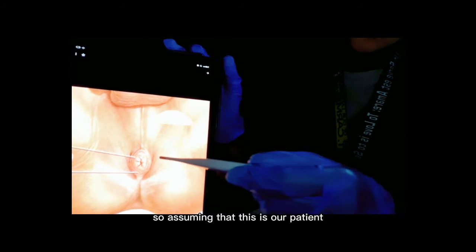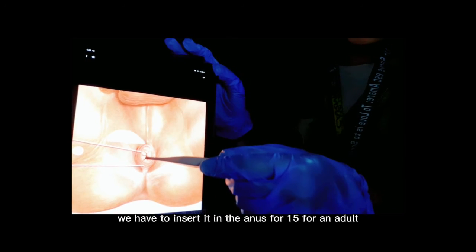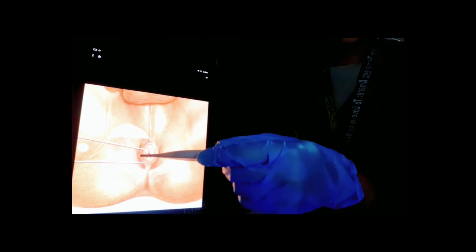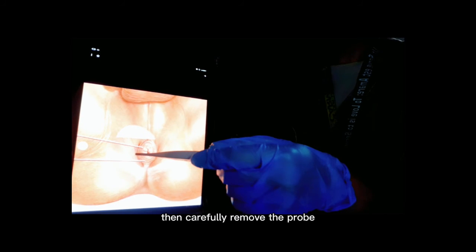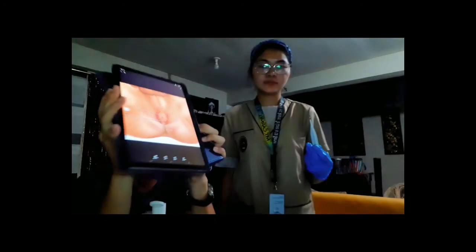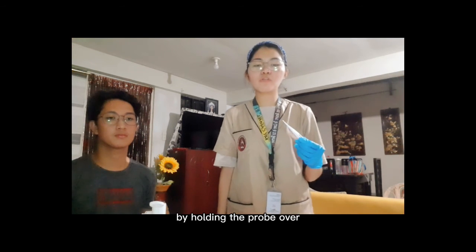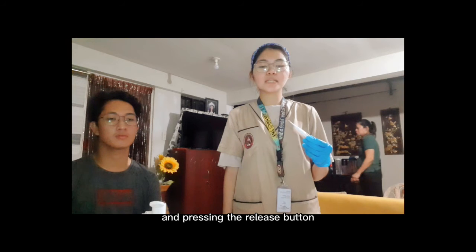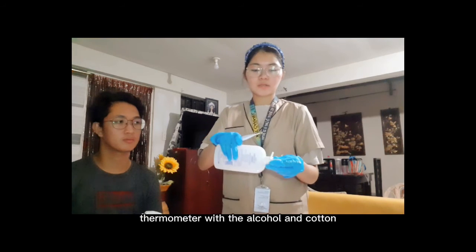So, assuming that this is our patient, we have to insert it in the anus for 1.5 inches for an adult and 1 inch for a child. Then hold the probe in place until we hear a beep. Then carefully remove the probe and note the temperature reading on the display. After that, we're going to dispose the probe cover by holding the probe over an appropriate waste receptacle and pressing the release button. So we have to again disinfect the thermometer with alcohol and cotton.